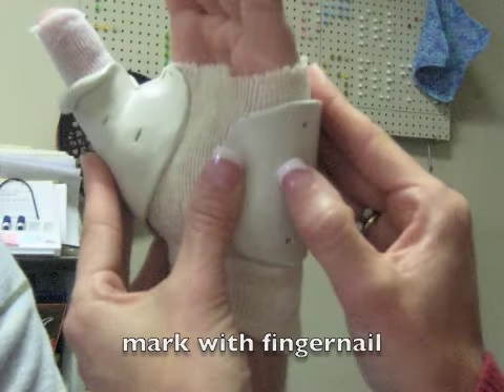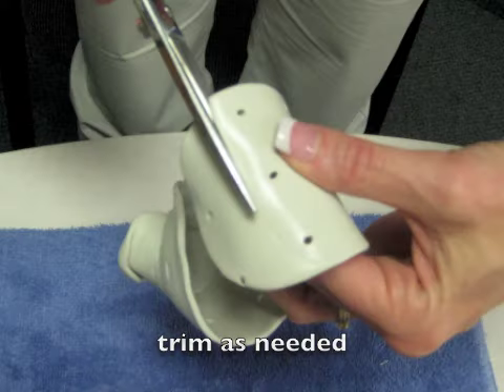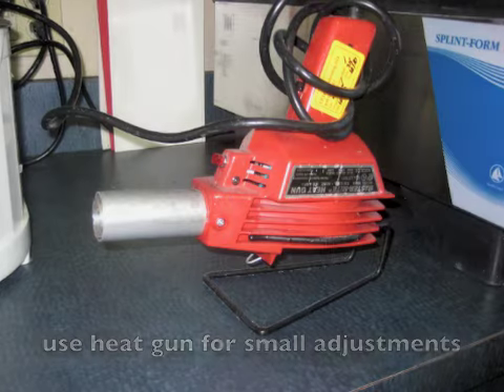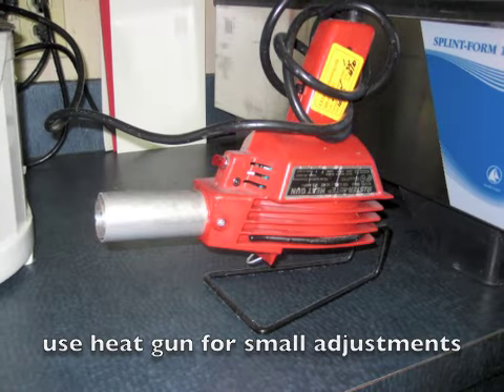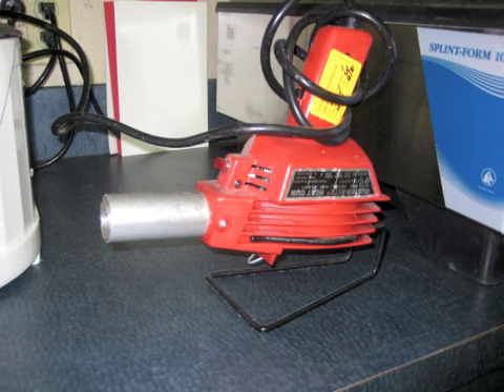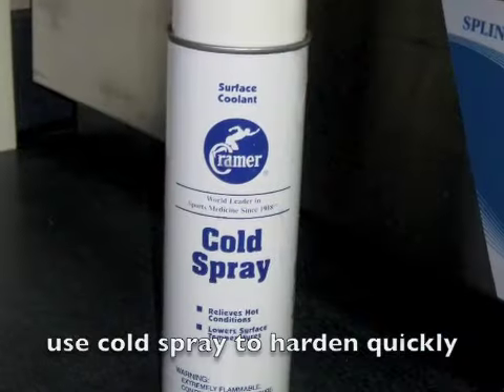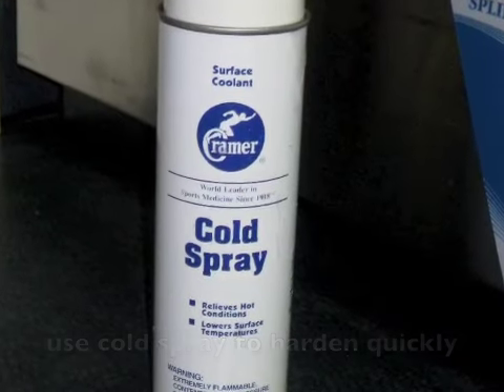Changes to be made can be marked on the splint with a fingernail and then cut once removed. Fine adjustments can be made using a heating gun, or a part of the splint can be dipped back into the splint pan. Be careful when using the heating gun and cool as directed. Cold spray can be used to harden materials quickly.